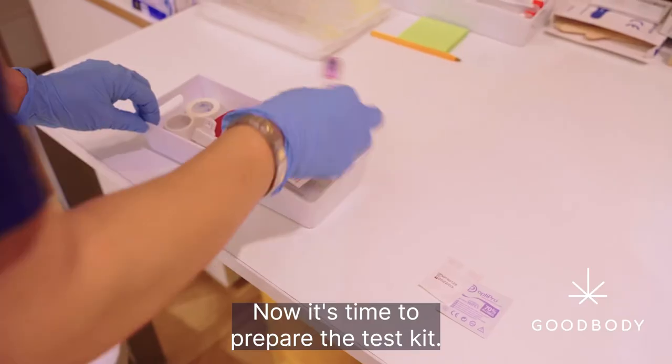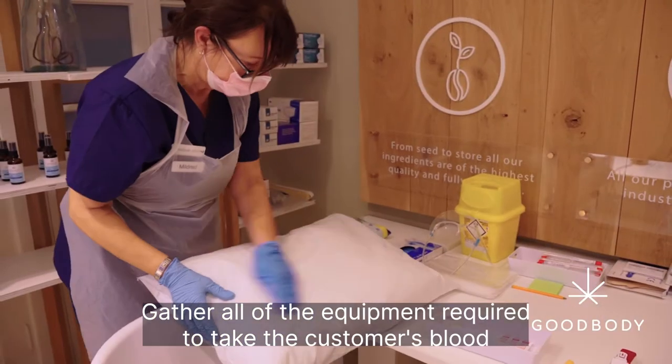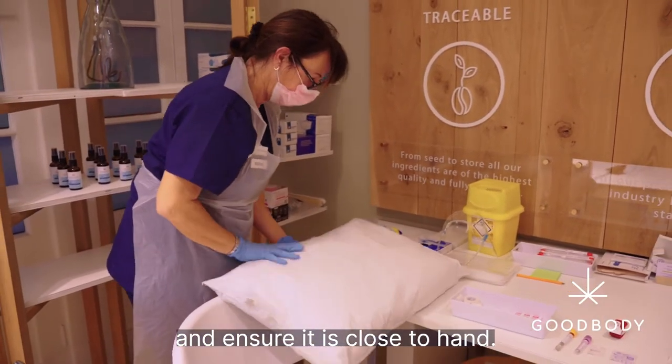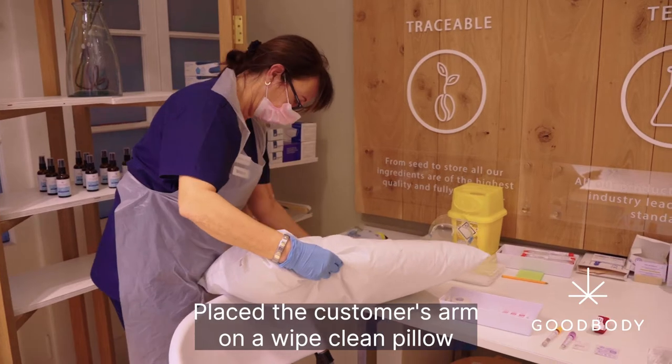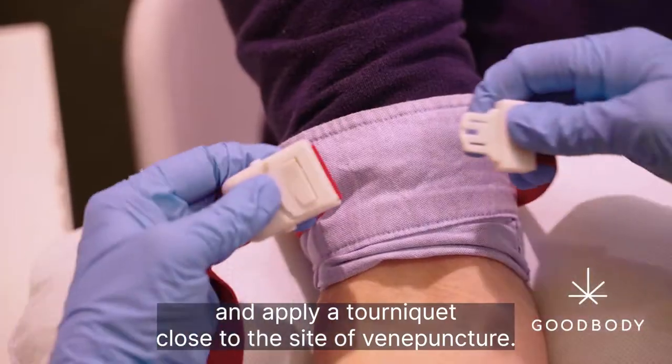Now it's time to prepare the test kit. Gather all of the equipment required to take the customer's blood and ensure it is close to hand. Place the customer's arm on a wipe-clean pillow and apply a tourniquet close to the site of venipuncture.